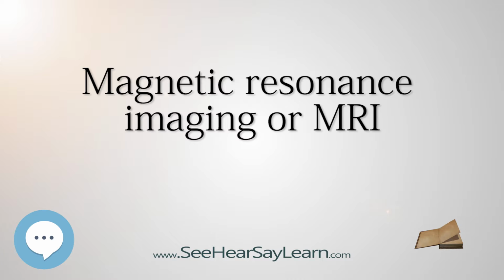Because the available signal is used to encode spatial and spectral information, MRSI requires high SNR, achievable only at higher field strengths, 3T and above.